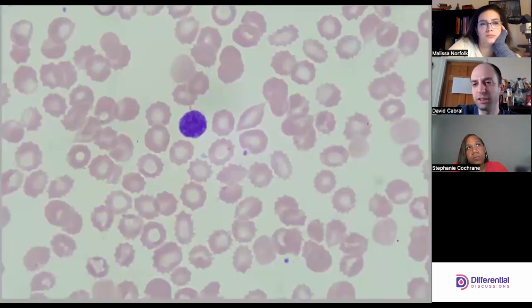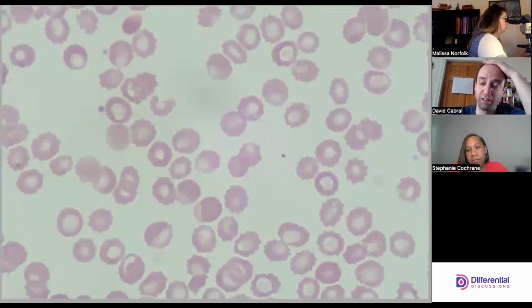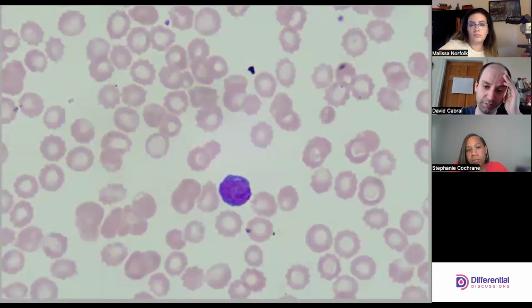I think that we saw some cells that look like they're reactive, and so that makes me think infection. And we have pancytopenia, which pulls me towards an aplastic anemia, some kind of bone marrow failure. But I guess infection can cause echinocytes, burr cells too, right? So that looks like a reactive-ish lymph, right? It's not full-blown. No, but the color of the cytoplasm is giving me reactive. Yep, way too basophilic. And the nucleus is clumpy for a baby lymph.